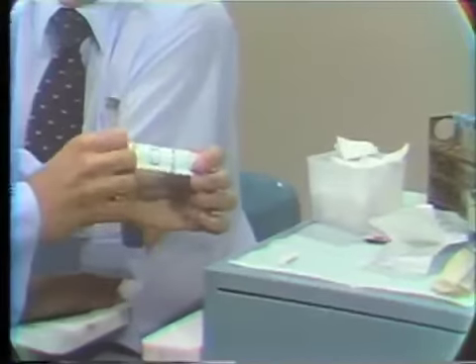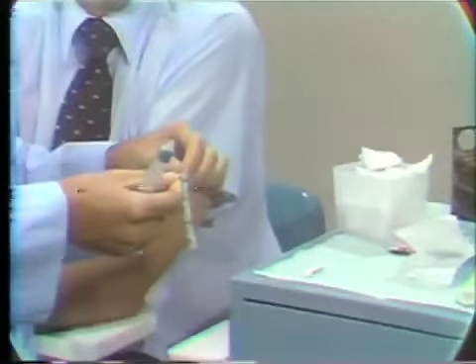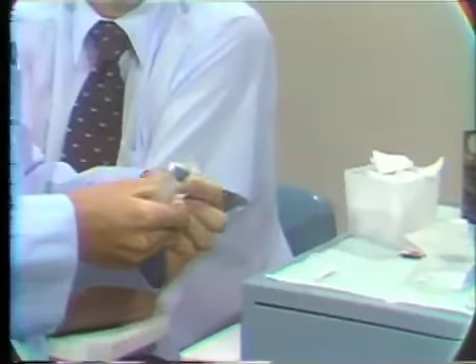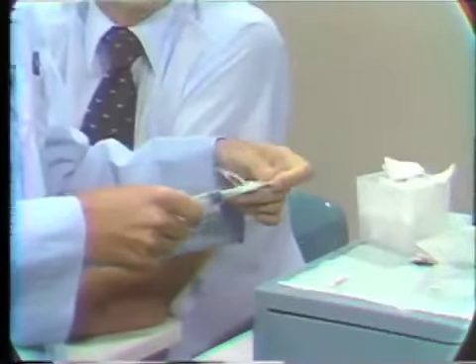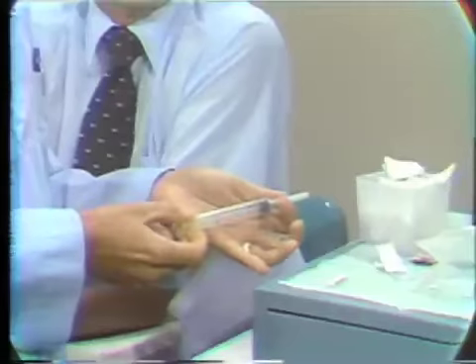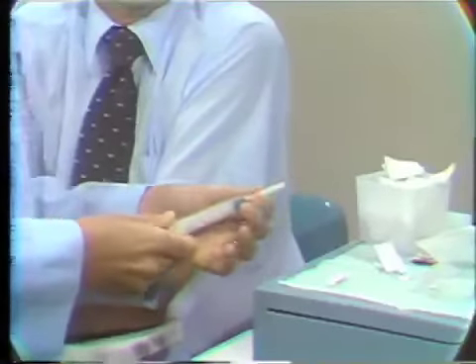The 21 gauge disposable needle comes in a disposable packet, again with two ear-like tabs. These tabs are torn back, exposing the hub, which is screwed tightly on the syringe. The protective cover is loosened and again tested to make sure that there's no blockage.